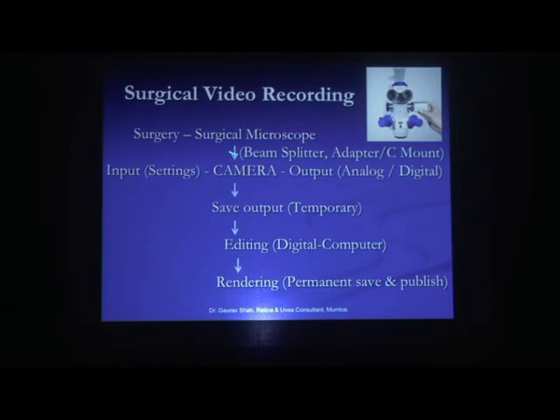Now, once this camera is fit onto the surgical microscope, it is receiving the signals of the surgery, and there will be an exit where the signals from the camera will be coming out. And we will discuss again whether these are analog signals or digital signals and how do we process them.